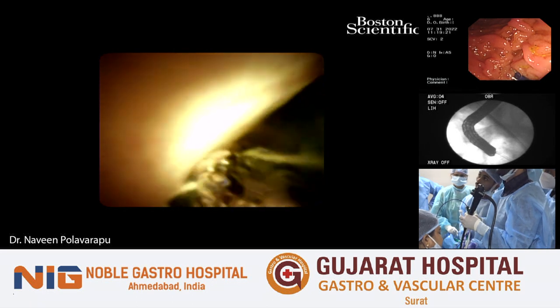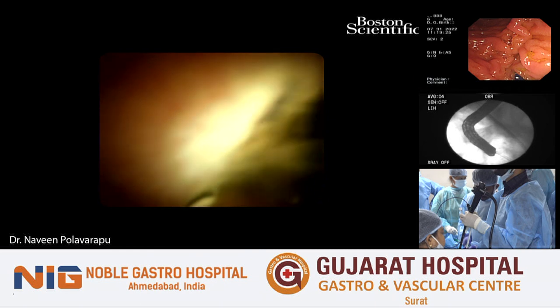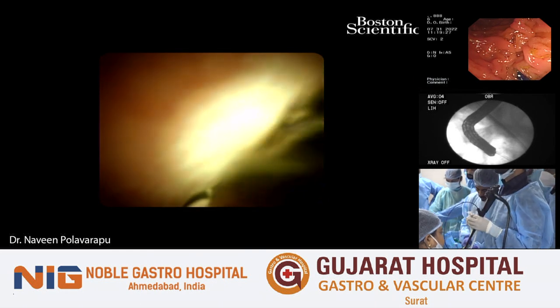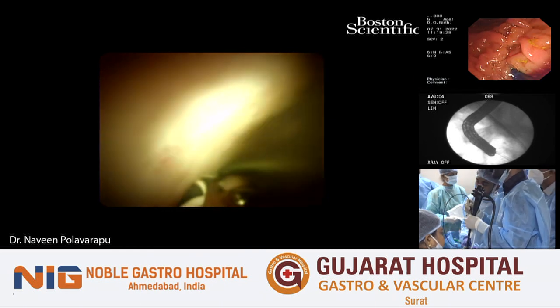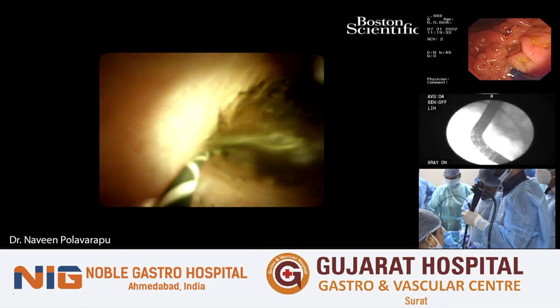We are right at the hilum there. You can see the hilum in here. You see the white curled.